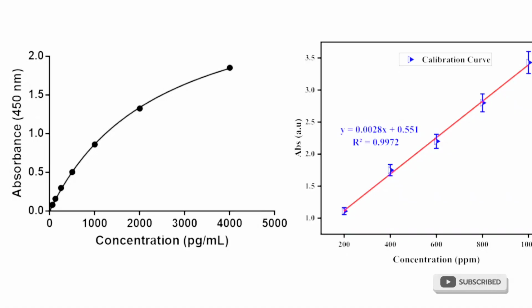Why are you diluting it? You are trying to bring the concentration to be within this very absorbance range, so that it can give you a specified concentration. Because once you get absorbance within this very range, any concentration it gives you is reliable, because your quality control is measuring within this very absorbance and this very concentration. Does that make sense? So once you get a result outside its specified range, it will give you a result that has failed linearity, and you will then have to dilute it.